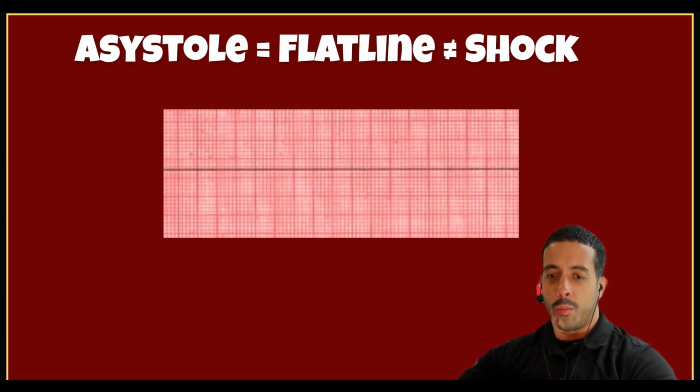This is not shockable. If you find a patient in asystole, the odds are that this patient has been in cardiac arrest for quite some time.